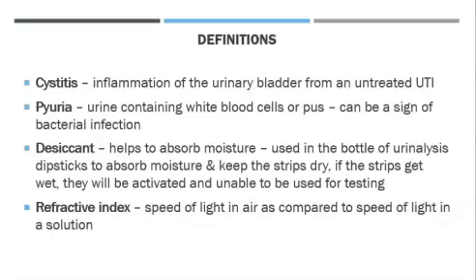Finally, the last definition we need to be aware of is the refractive index, and this is just the speed of light in air as compared to the speed of light in a solution, and we have to be aware of that when we're looking in the microscope at urinalysis specimens.